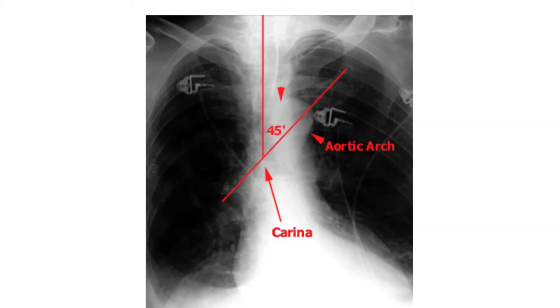Another way to find the carina is called the D-way. You find the arch of the aorta and draw a line inferiorly and medially to midline at a 45-degree angle — that gives you the carina. Even without that line, you can see the left main stem here and the right main stem here, confirming the location.